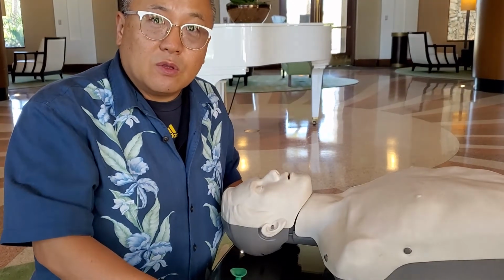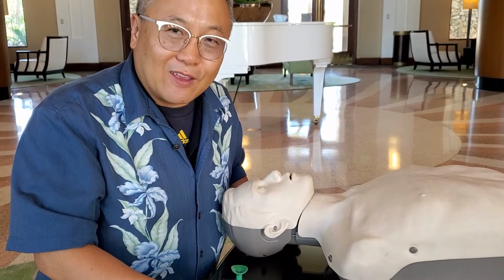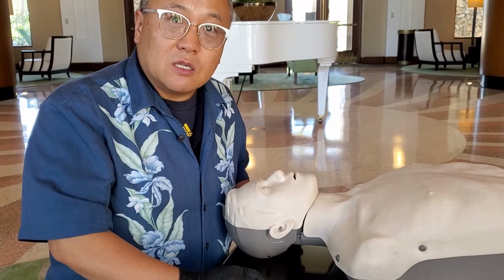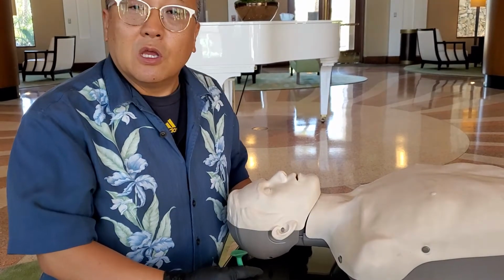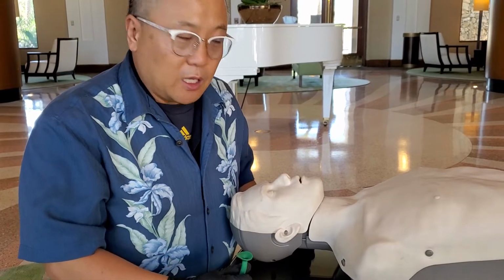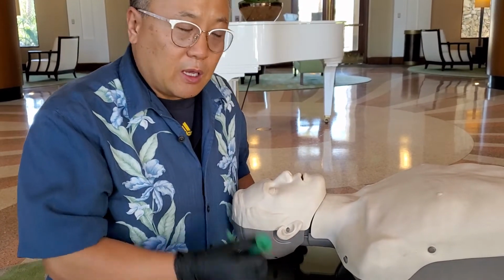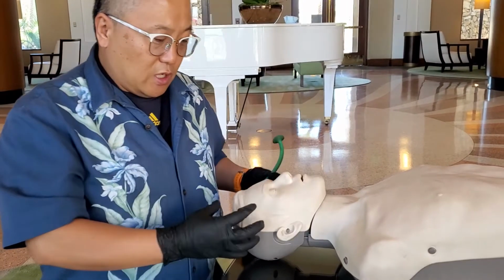NPA stands for nasopharyngeal airway. Nasopharyngeal airway. Okay. This NPA, we can use whether the patient is conscious or unconscious, both. So you can use it. And then the contraindication of the NPA: if a patient has a facial trauma or head injury, we do not use NPA. Why? When you put in the NPA through the nose, what's going to happen?